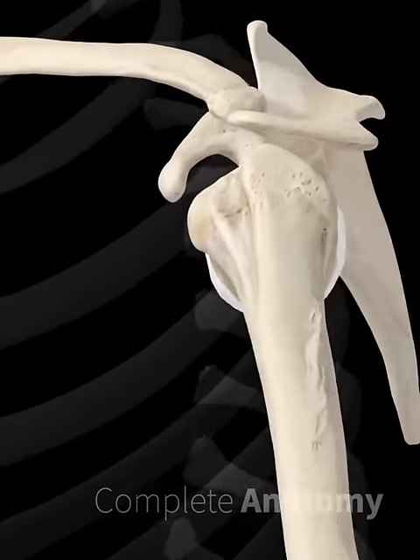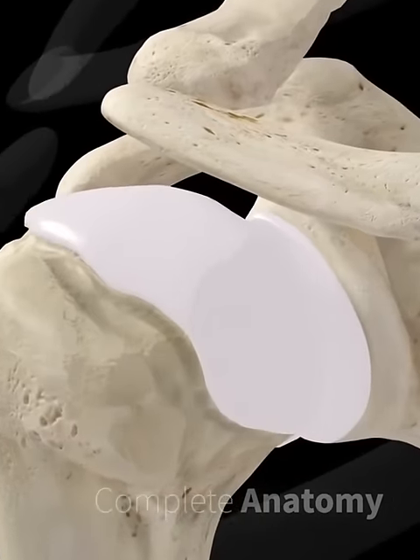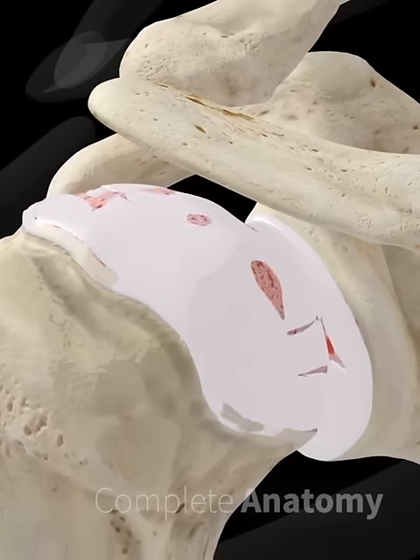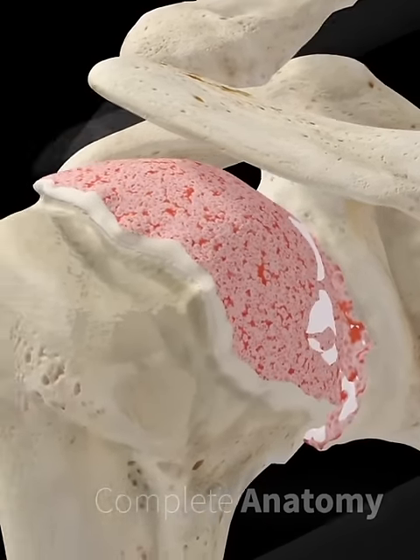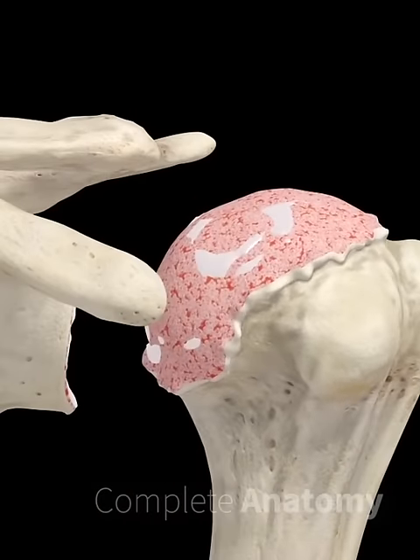Shoulder arthroplasty is a surgical procedure used to relieve the pain and loss of joint mobility associated with arthritis. These conditions involve loss of joint cartilage and wearing of the bone, causing restricted mobility and pain.